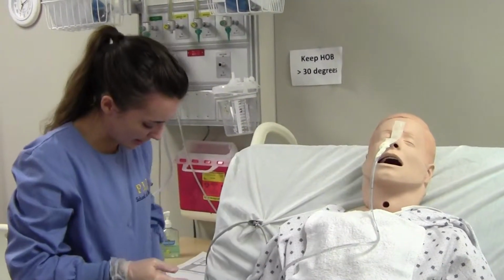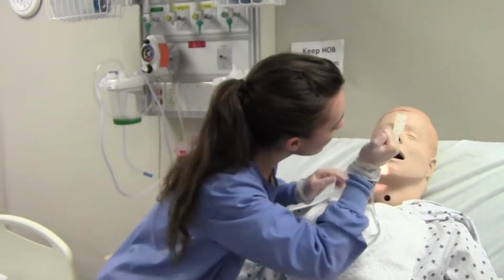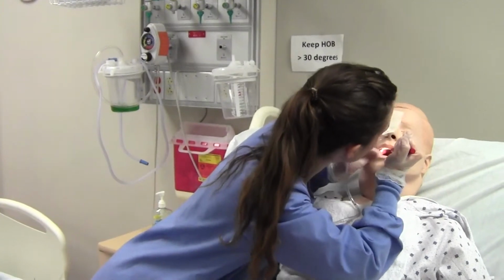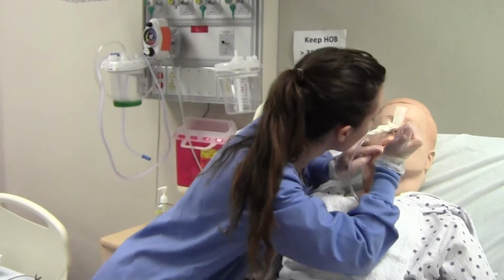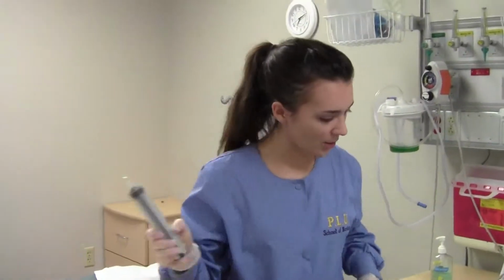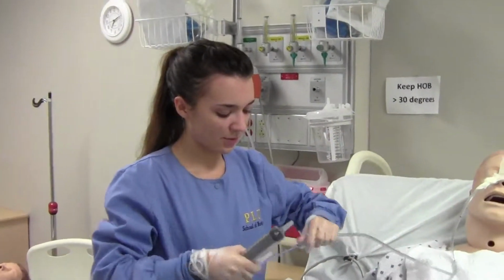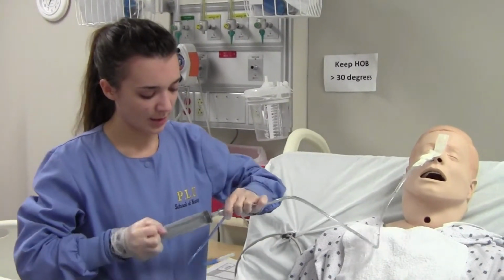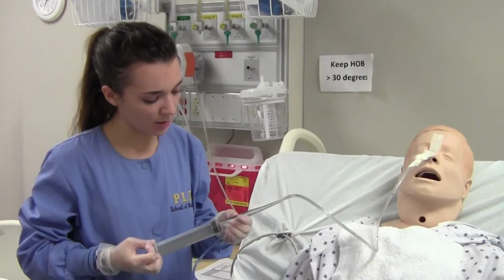Okay, I'm going to take my pen light actually. We're going to look back here. How's everything looking? Everything's looking okay. Okay, wonderful. So now, we're going to take this. We're going to see if we're in your stomach. We're going to pull that out. Make sure that's all out. We're going to see if we can get any stomach contents out.